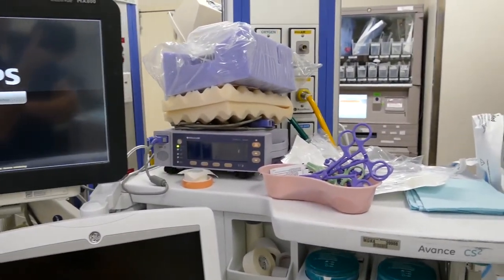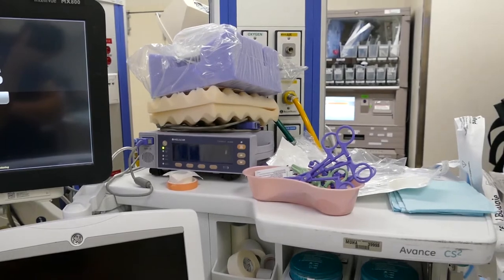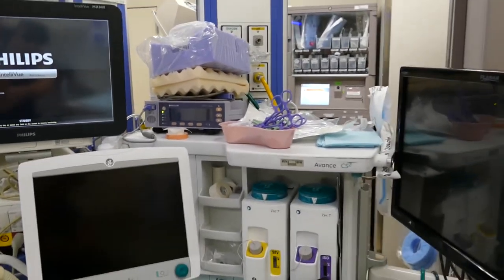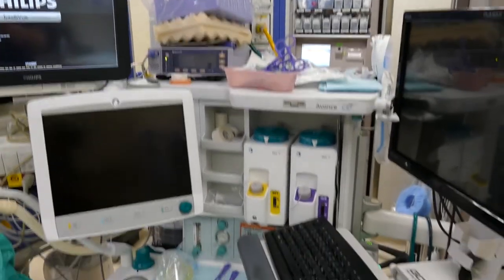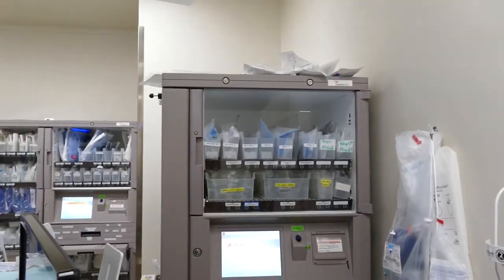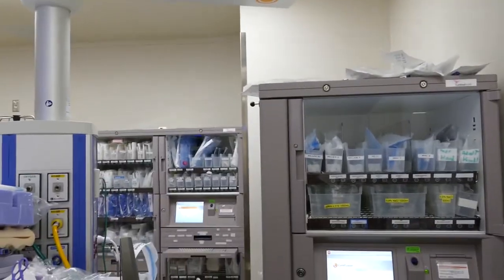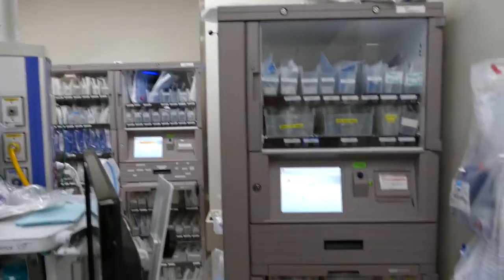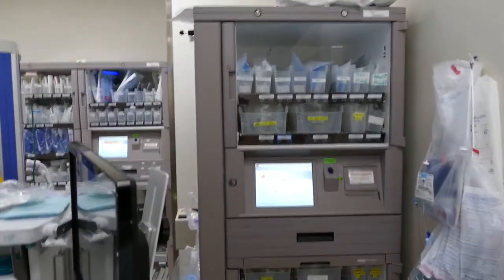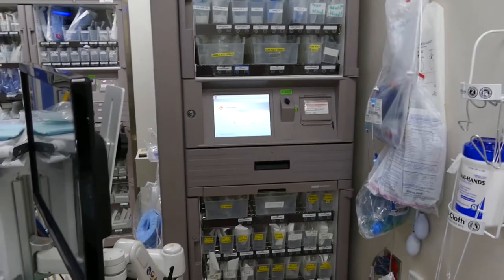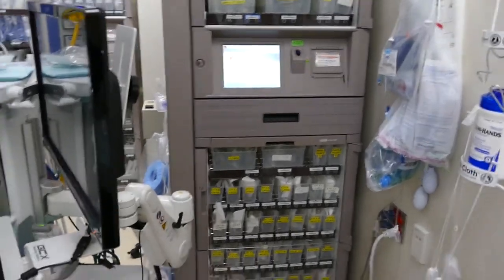Up here you have a pulse oximeter that will measure the amount of oxygen in the patient's blood. Over here is a Pyxis machine — you can see it in the background. Those make sure that when a consumable is removed, it's charged to the patient's account.